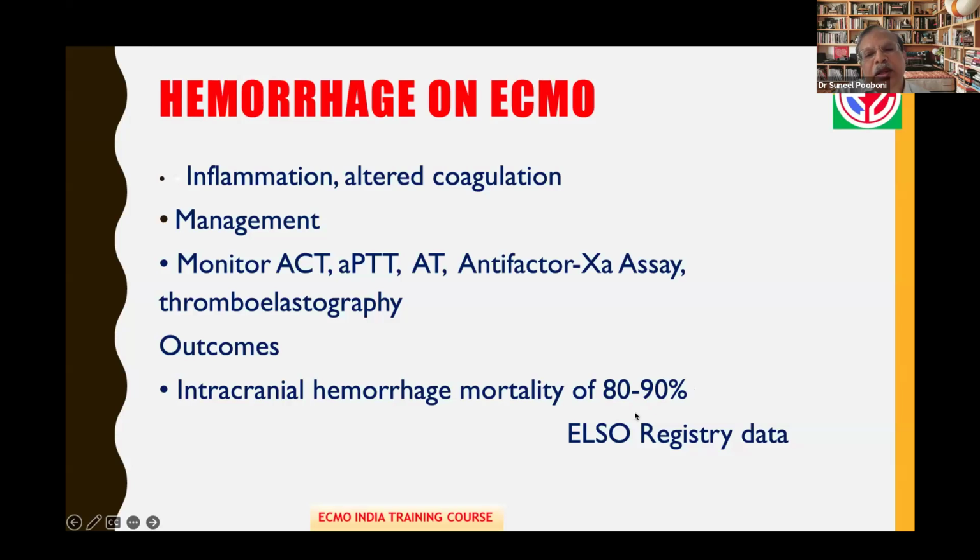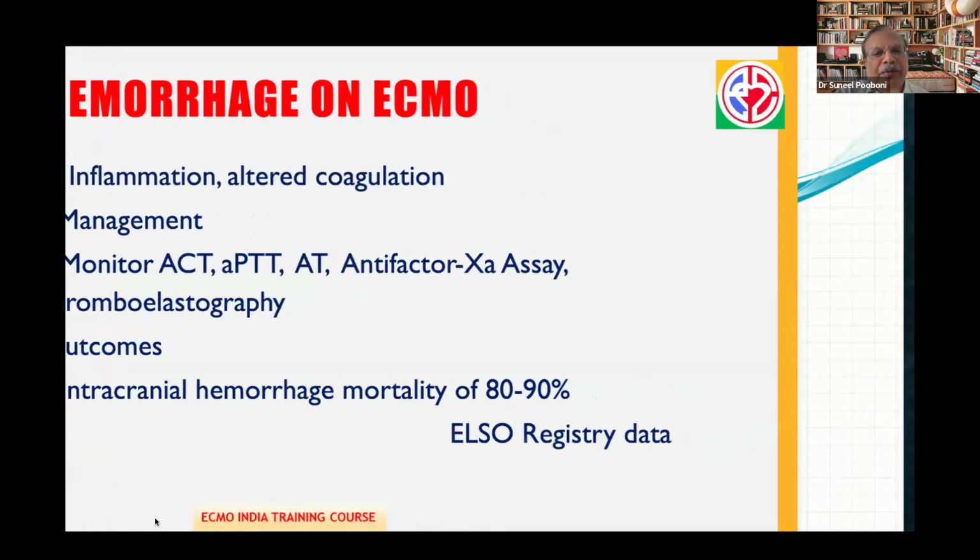Intracranial hemorrhage has a mortality of 80 to 90% as per ELSO registry data, so one has to be very careful with this. If ECMO is life-saving and the patient is very likely to die if he comes off ECMO, in view of this intracerebral bleed, you can consider heparin-free ECMO for that period. Most important is dynamically watching what is happening to this bleed over the next few hours, and you can take a decision about continuing or stopping the ECMO. So this is an MDT decision at this point of time.